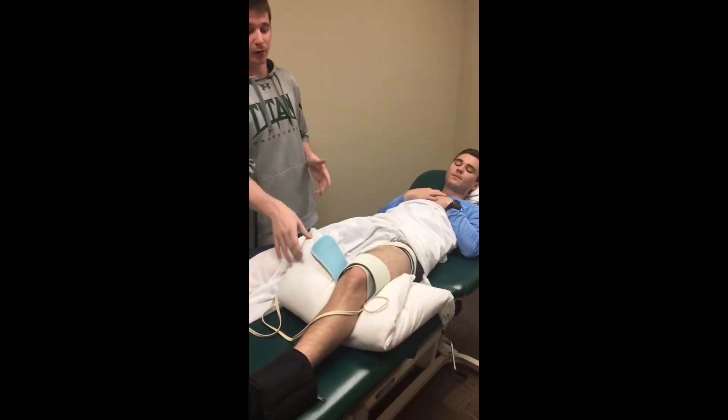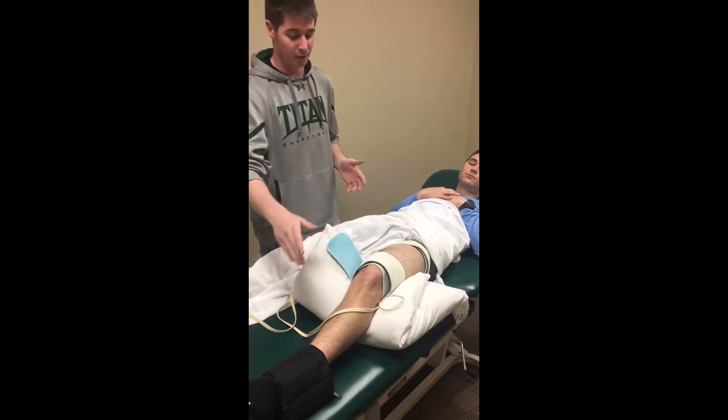We set up the patient supine with a pillow under their knee, giving it that little bit of flexion.